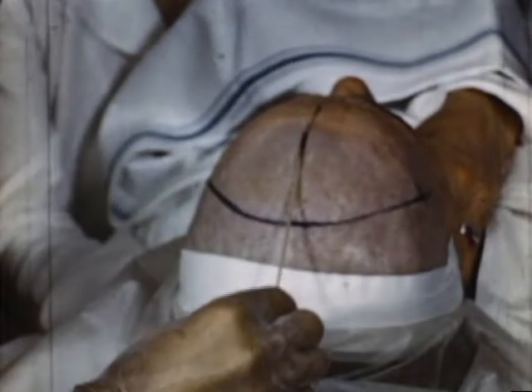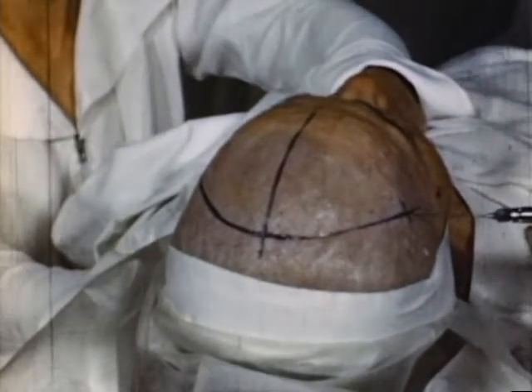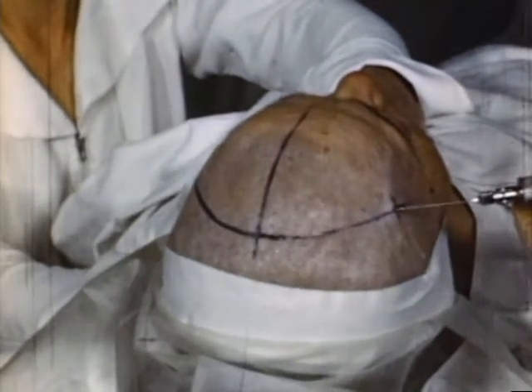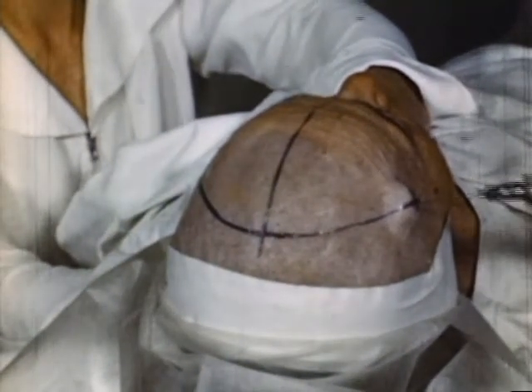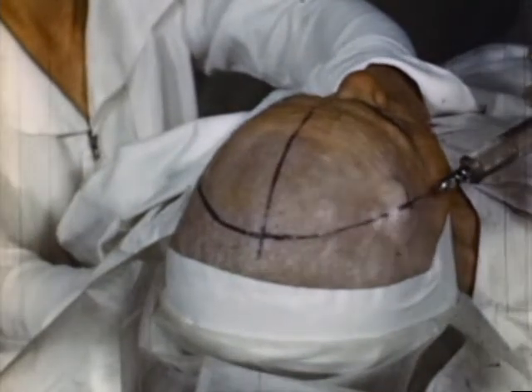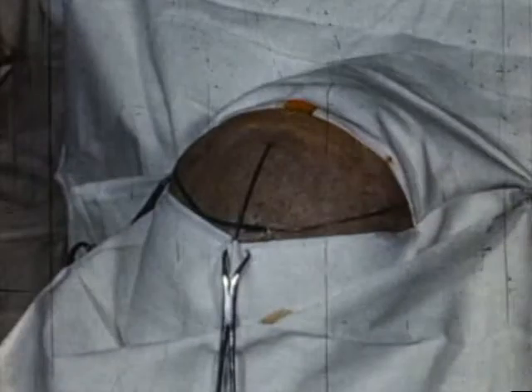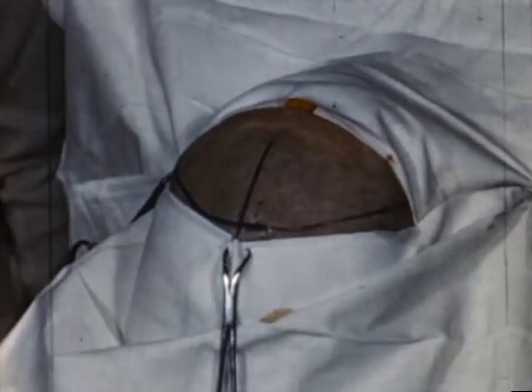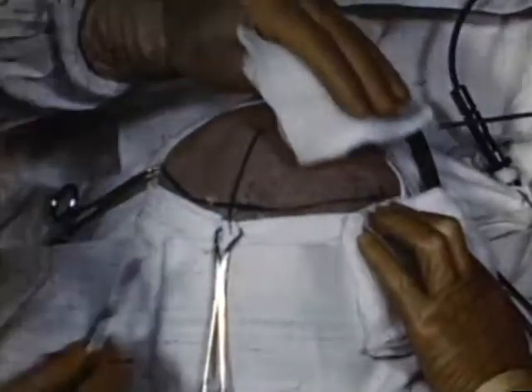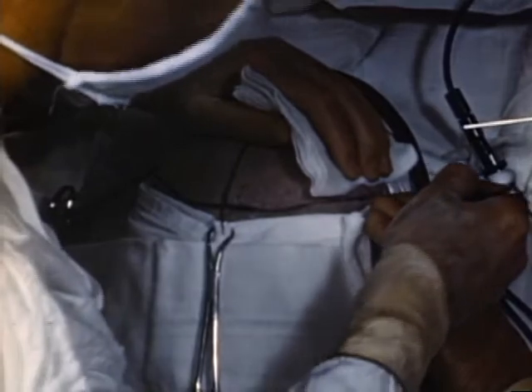Operations can be performed under local anesthesia if the patient is sufficiently cooperative. An incision through the scalp along the indicated line exposes the coronal suture.